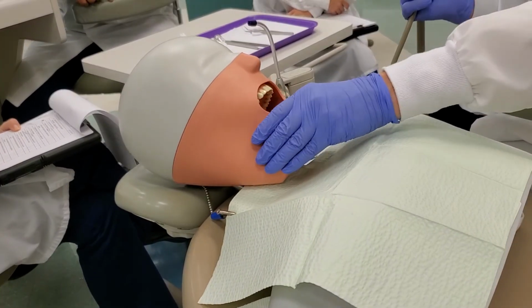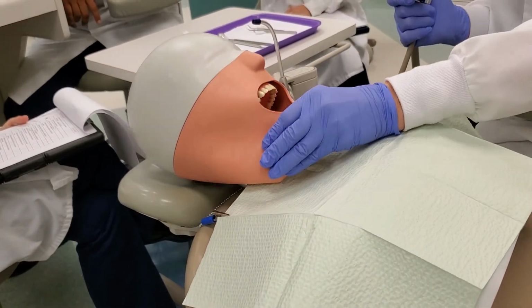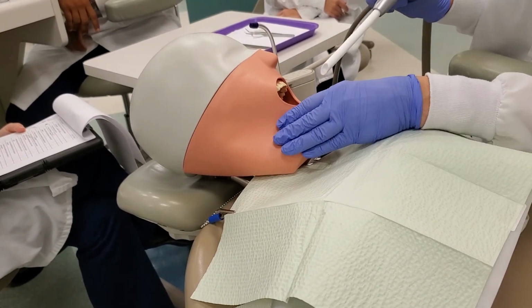And you can have your patient, if this was a real person, have them look at you, have them look away. Just say, can you look at me? If you can't see, they're looking this way, just have them turn their head so you can see better.